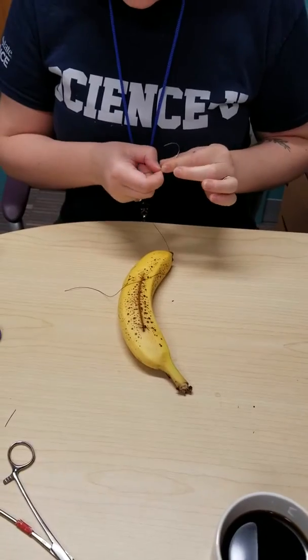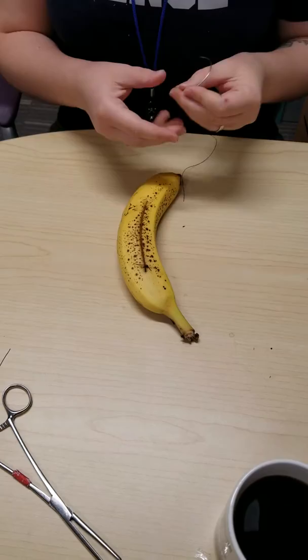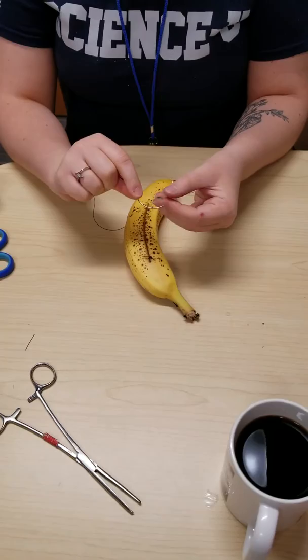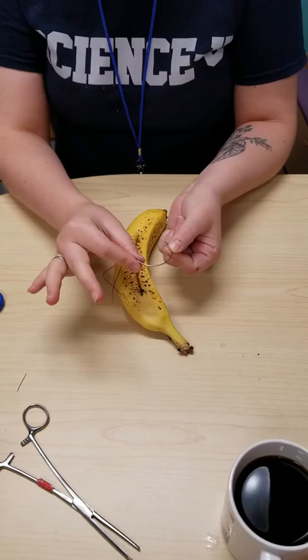For the next suture practice demo, we're going to use a banana. We've made a cut in the banana with some scissors, and this is where we'll be putting our sutures. We've got a big, curvy needle — this is larger than the ones that surgeons use, but for today it will work. We've put some string through one end, and we've got about a foot of string to work with.